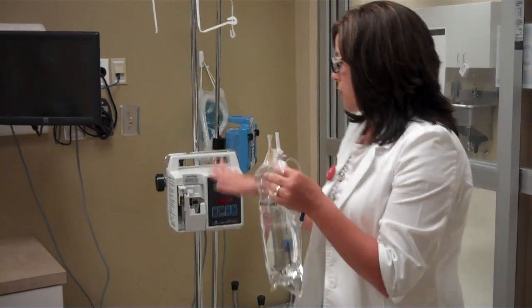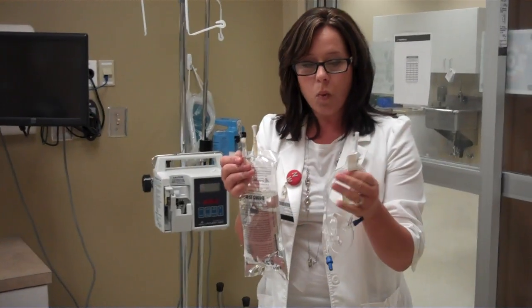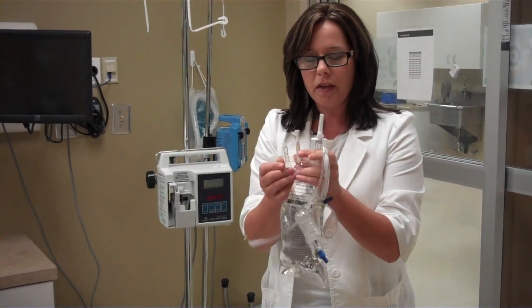I'm going to demonstrate how to use the Plum Pump. I'm going to go through priming the IV one time really quick because it's a little bit more difficult than the Alaris.